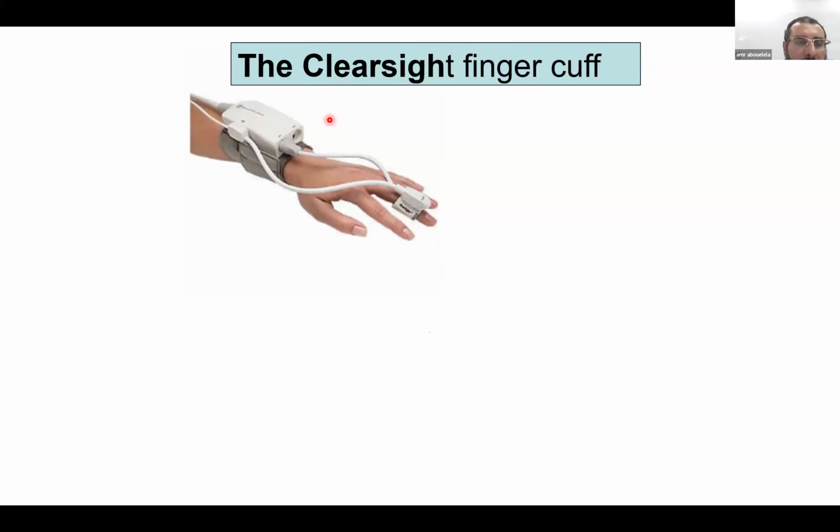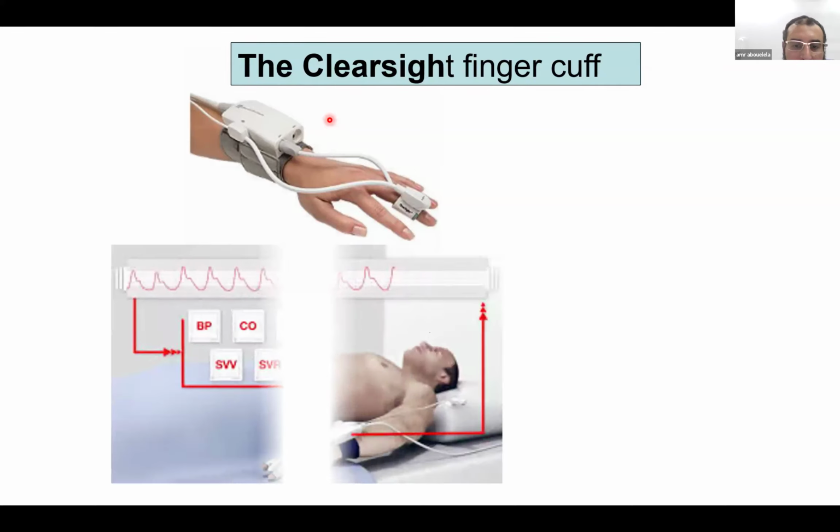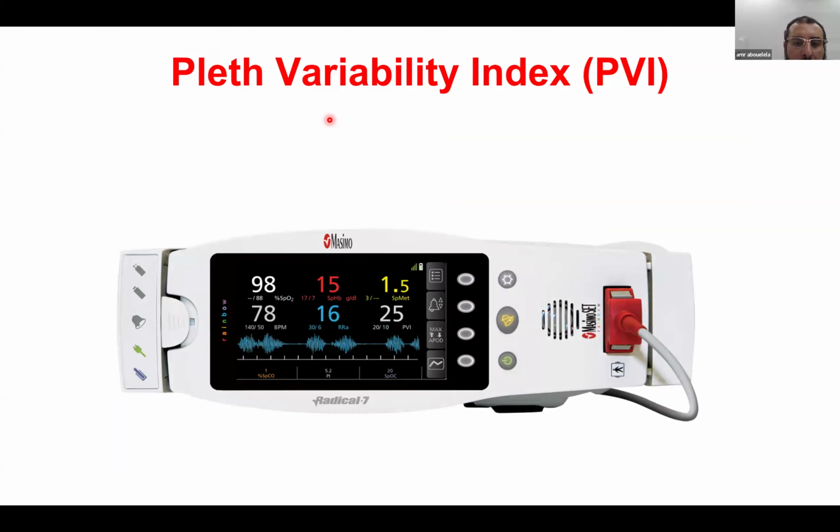They are checking again the variation in the size of this wave. And there is another monitor here, which is also the Masimo. They are checking the PVI, or plethysmography variability index, which is the same as the stroke volume variation, and a number more than 13% variation will denote the patient is responsive.